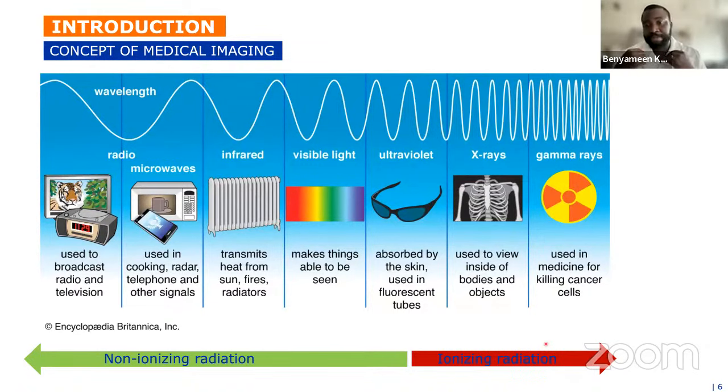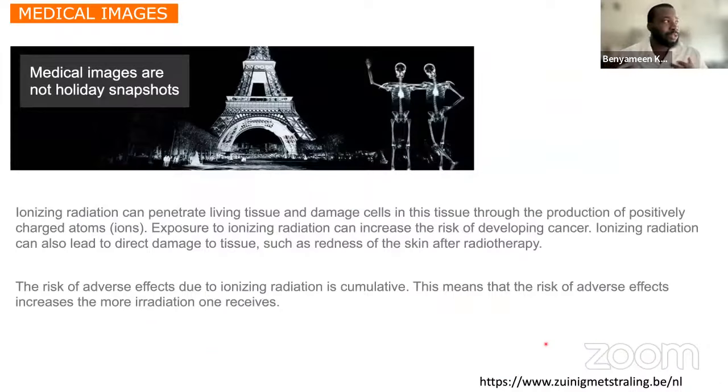The fact that they can penetrate the body also means they have implications. It's important to take into consideration that using ionizing radiation is not like taking any other pictures, and it's important to keep in mind that there are some risks to doing these types of images.